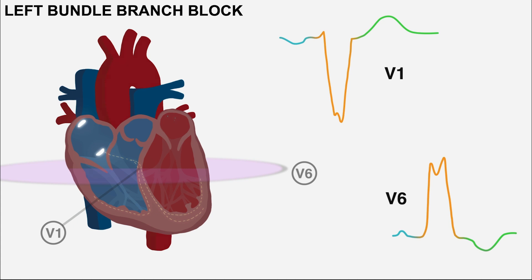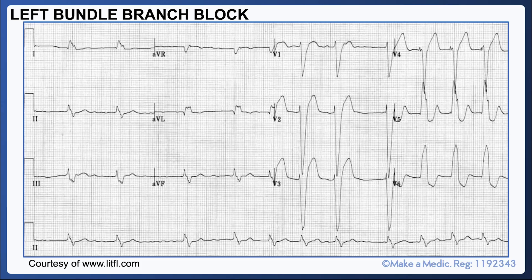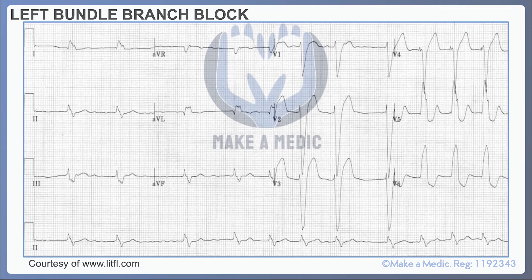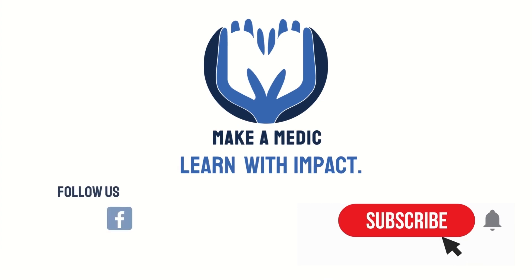As in the case of right bundle branch block, abnormal depolarization will be followed by abnormal repolarization, so you would expect there to be T-wave discordance. This is what a 12-lead ECG looks like in left bundle branch block — you can see large broad QRS complexes going in a negative direction in V1 and a positive direction in V6, and you can see that there's T-wave discordance as well.